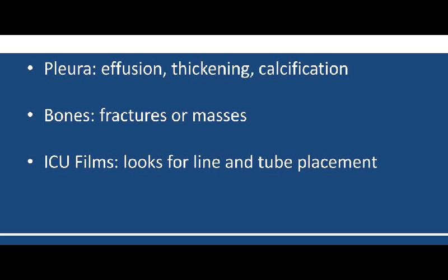And another important reason why we do this is that sometimes after an invasive procedure, maybe a tube placement for feeding or a nasotracheal tube and the rest, you actually do a radiograph to ensure that it was properly placed. Even cardiac pacemakers, after placing them surgically, we do a radiograph to ensure that they are properly placed. So this is also part of critiquing the film.